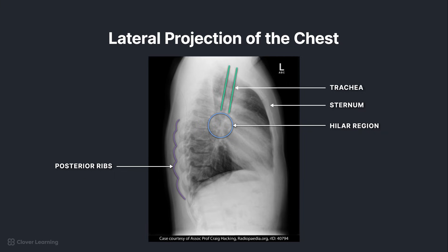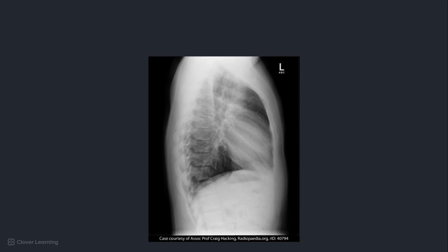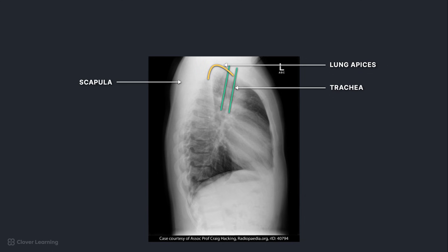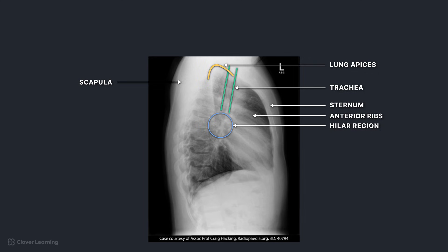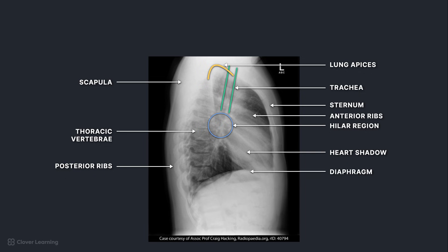The anatomy demonstrated on the lateral chest radiograph from superior to inferior includes the lung apices, scapula, trachea, sternum, ribs, hila region, heart shadow, thoracic vertebrae, posterior ribs, diaphragm, costophrenic angles, and gastric bubble. Were you able to correctly identify the anatomy of the chest on both projections?